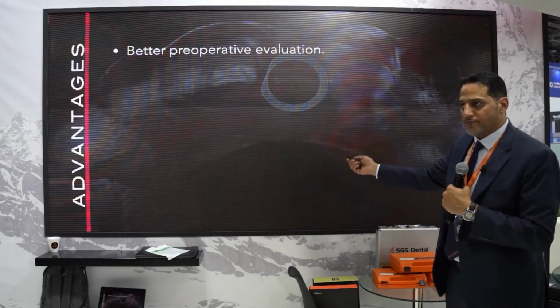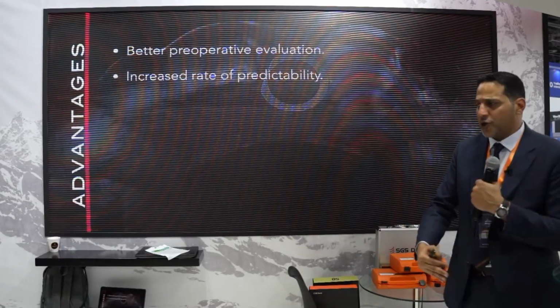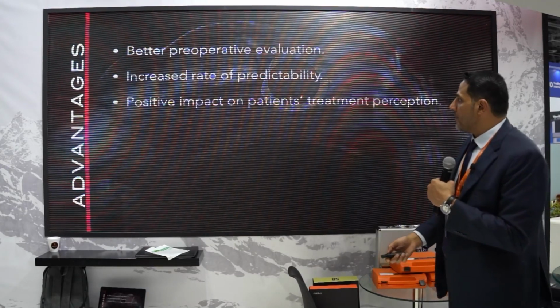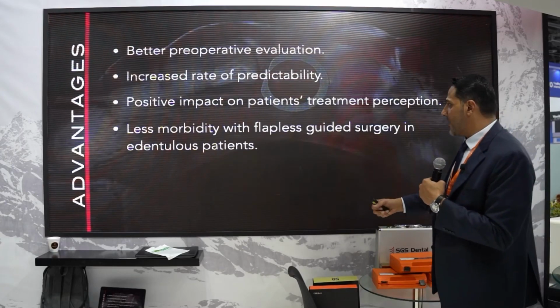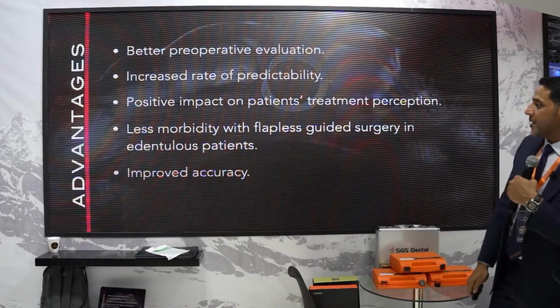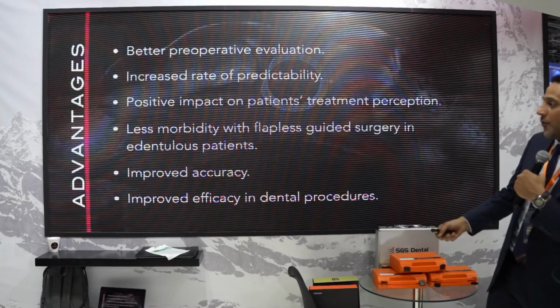So the advantage is that we can analyze the case, study the case before we go to the surgery. It increases the rate of predictability, patient comfort, less morbidity, especially if we don't open the flap, flapless technique, accuracy, and improves the efficiency of the dental procedure.